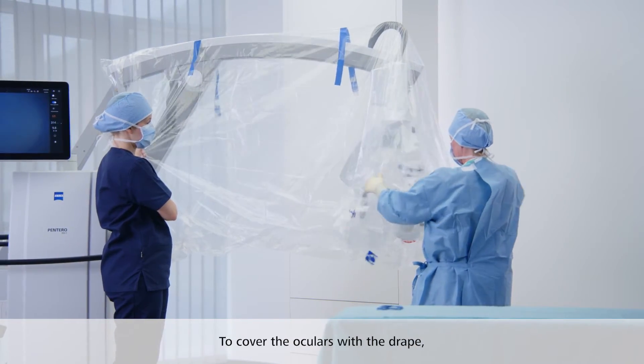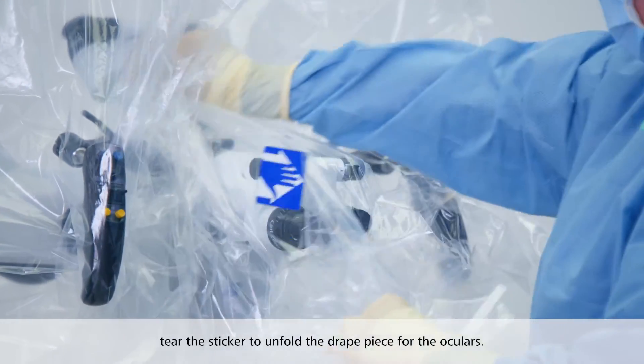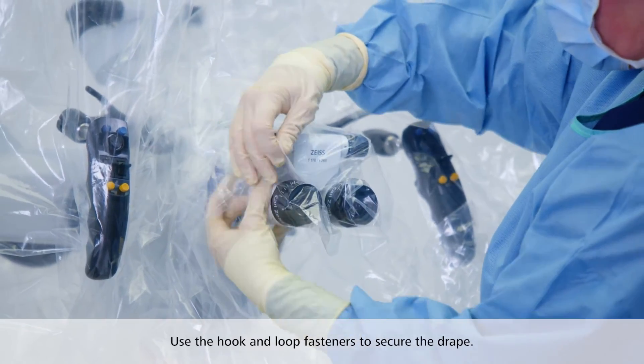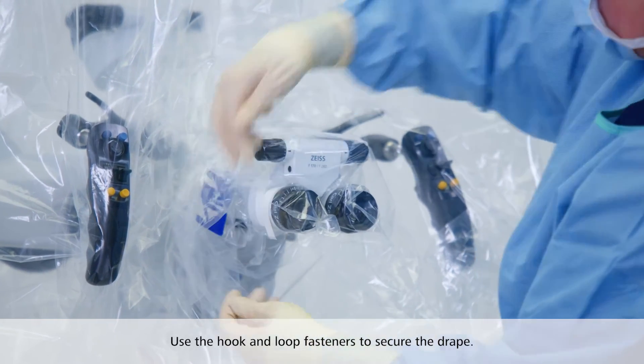To cover the oculars with the drape, tear the sticker to unfold the drape piece for the oculars. Use the hook and loop fasteners to secure the drape.